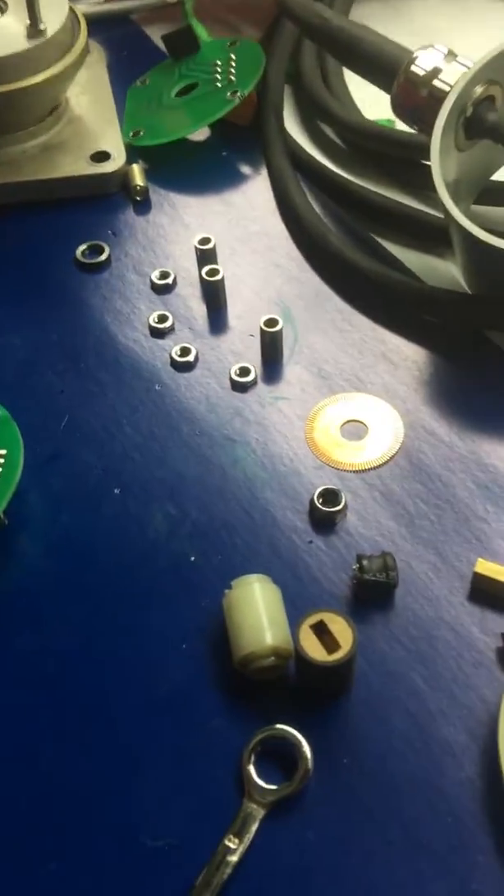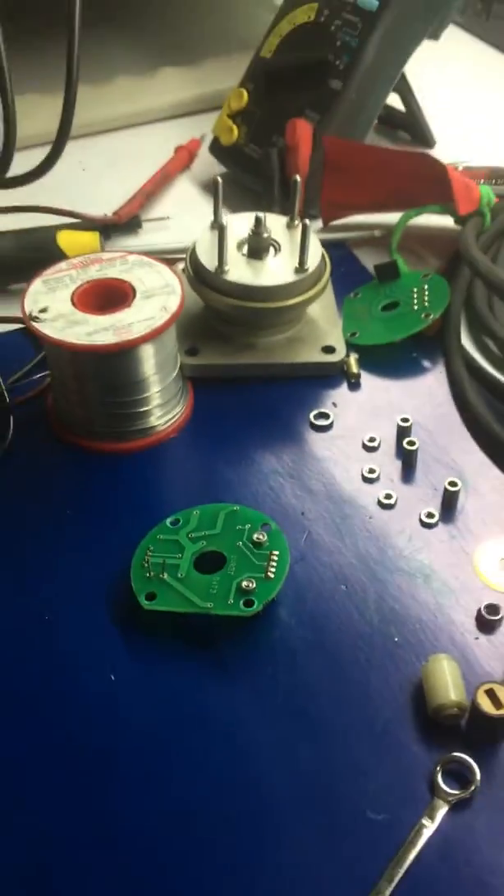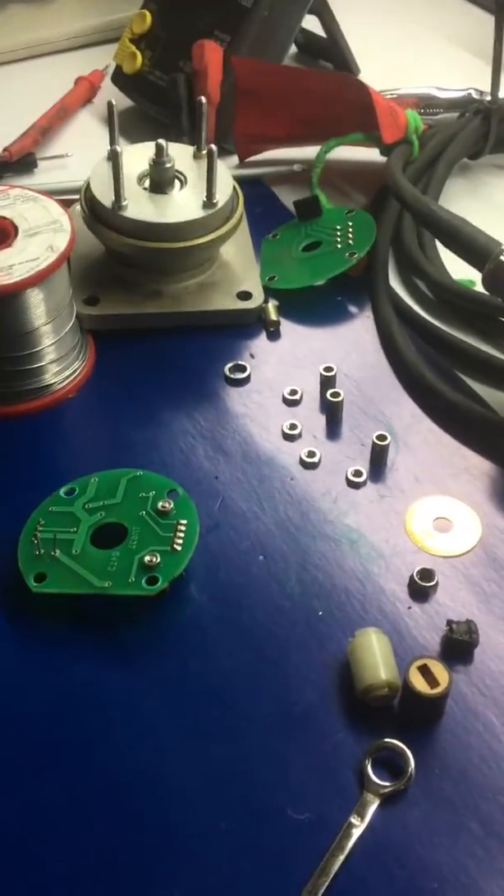That's all what we did to repair the ATP sensors. Thank you.